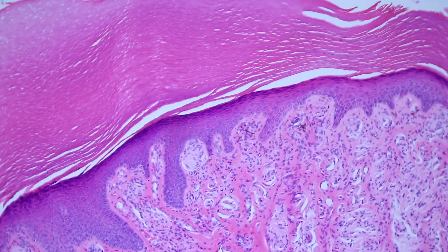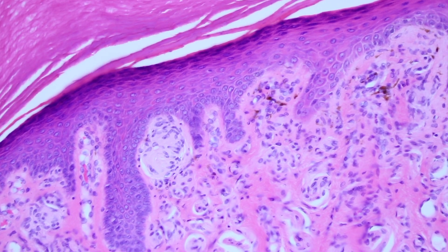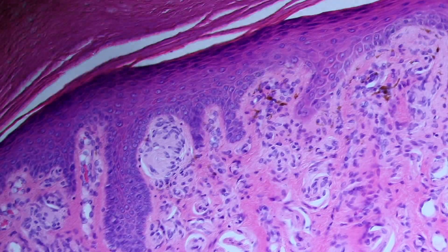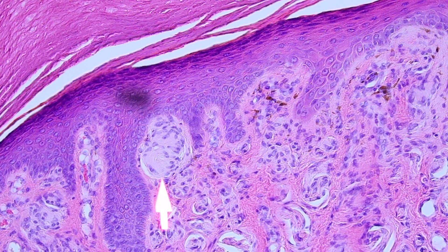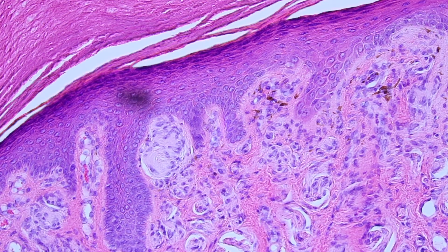Oh look, that's cute. See that little guy there? That's called Meissner's corpuscle. It's like a little ovoid structure made of a bunch of little cells that are kind of stacked together. If you flip your condenser, sometimes you can see there's kind of little thin layers of pink in the middle of this thing, giving a striped appearance that reminds me of a little Easter egg.